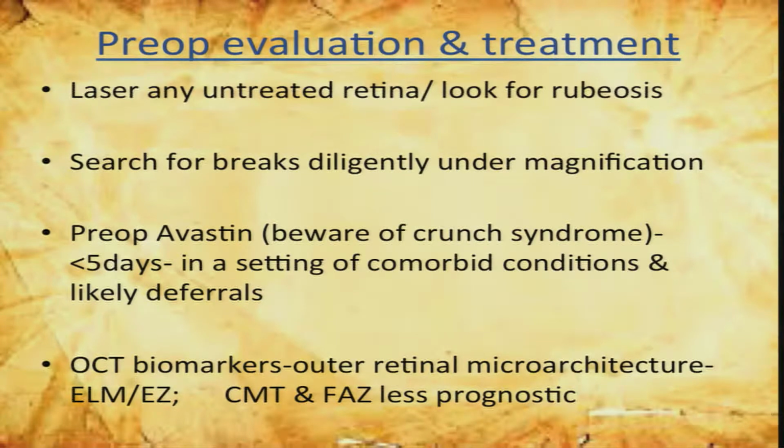Search for breaks diligently under magnification. This is very important. There may be a tendency to believe that the retinal breaks need not be identified. We are anyway going in, we can create an iatrogenic break for endo drainage.